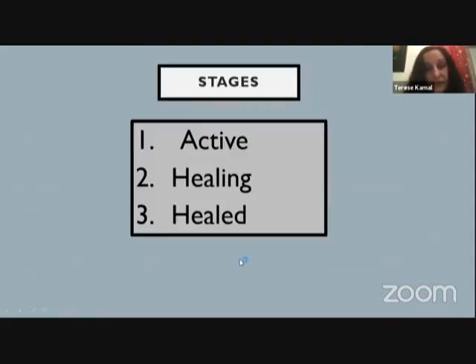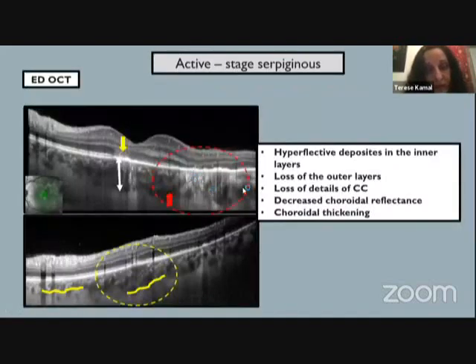Serpiginous choroiditis by imaging has been divided into active, healing, and healed. And let me elaborate for those who enjoy imaging or do imaging. Let me explain these different stages by the different imaging modalities.